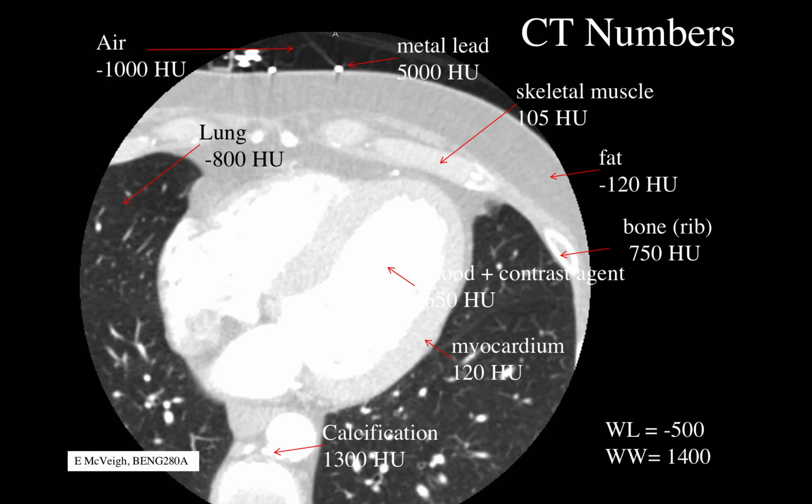Could you tell how much is included when you do an artery? Yes, absolutely. One of the problems with calcium in the coronary arteries is that oftentimes the calcium is quite large compared to the lumen of the artery itself, and the calcium has a very high brightness, high signal, right?